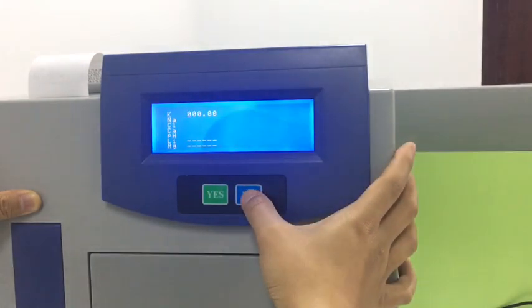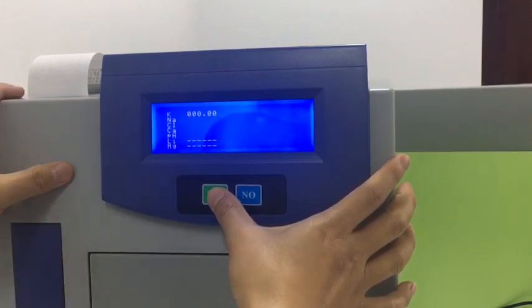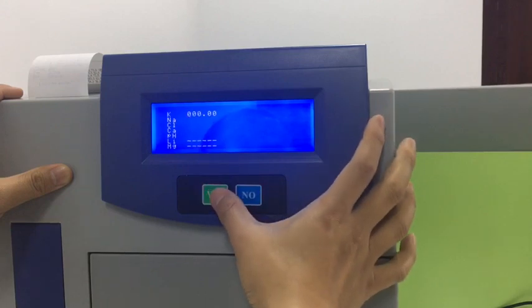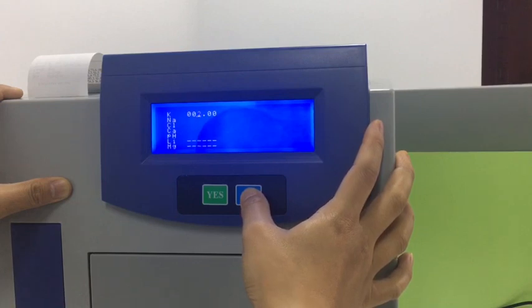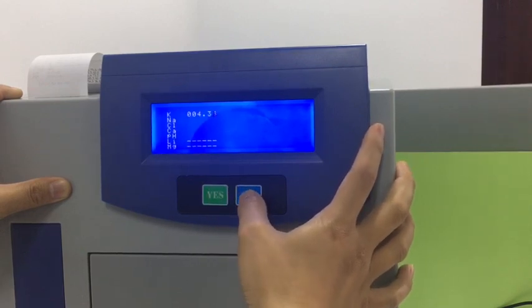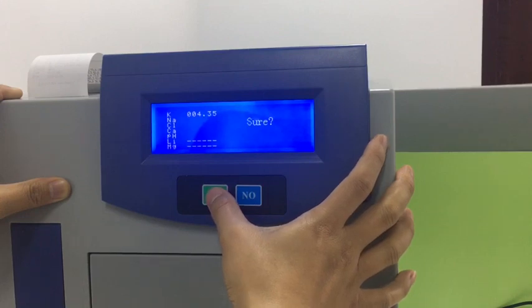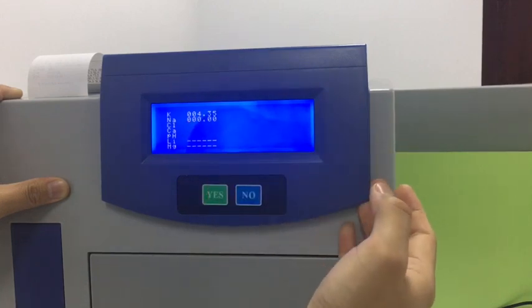Here we press no to change numbers and press yes to confirm the digit value. We press no to change it to the third digit and press yes to confirm. Press yes and we change the other parameters.